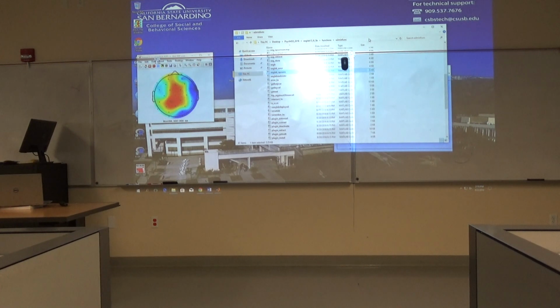Then hit administrative functions. Then go down, scroll to EEG lab. That one. That's just a little coding thing. Just go down to line 45. Okay. Yep. So that's fine. Delete that. Then you're gonna go all the way to... You didn't set that.